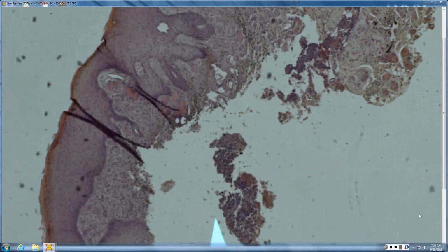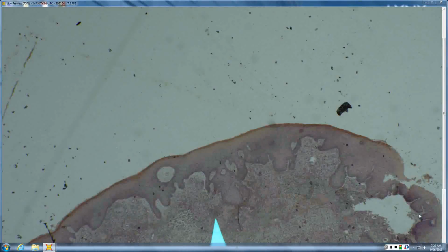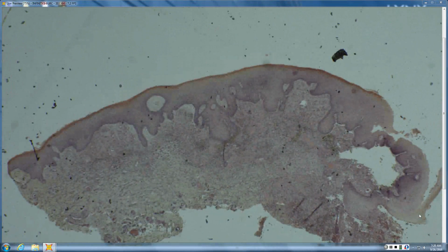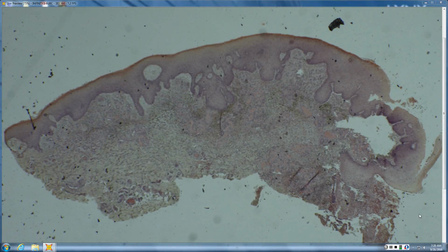Okay. 17. So this one is just stasis dermatitis, and it's in this chapter because classically you get a subacute spongiotic process, and it can also sometimes develop some psoriasiform changes, so very much both features.